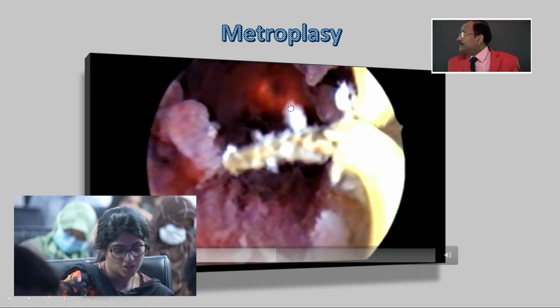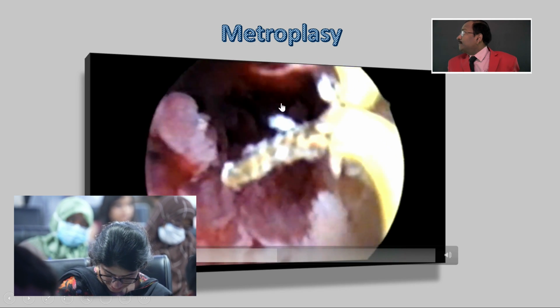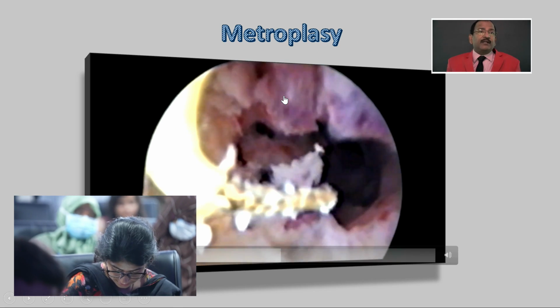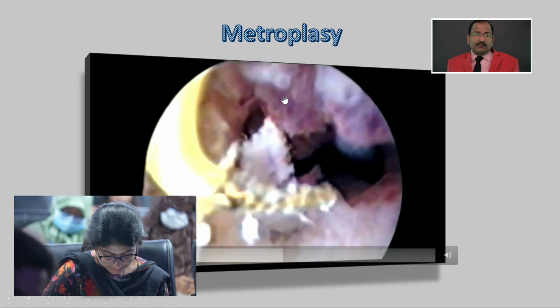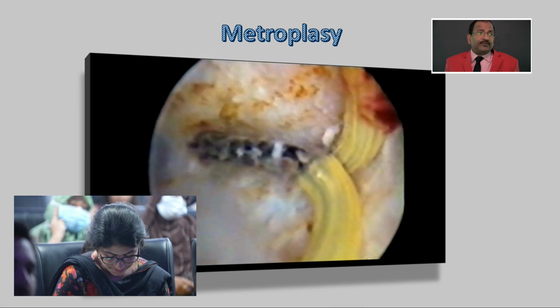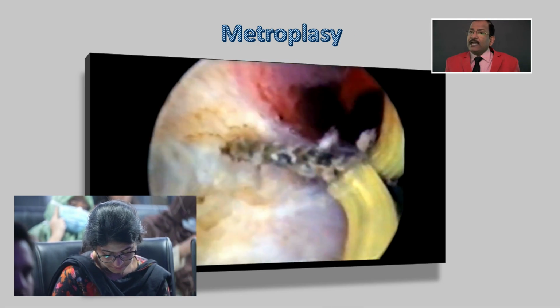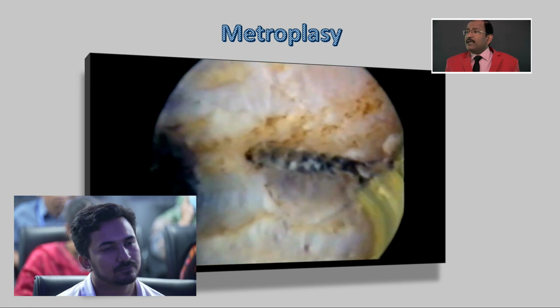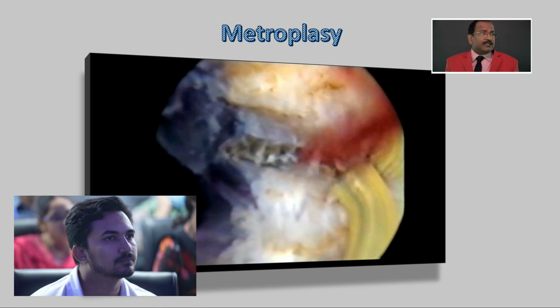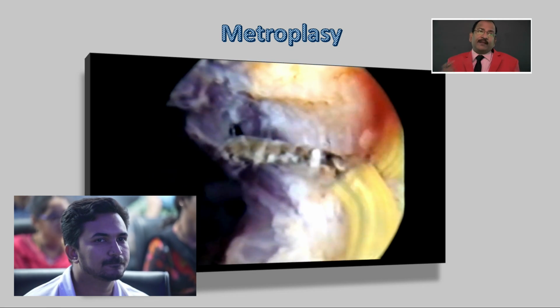This is the light of the laparoscope. It will be more visible once we reach near the fundus. So, under laparoscopic guidance, hysteroscopy is very useful, and that gives you depth perception, and that helps you to prevent perforation, and in case of perforation, it helps you to repair.